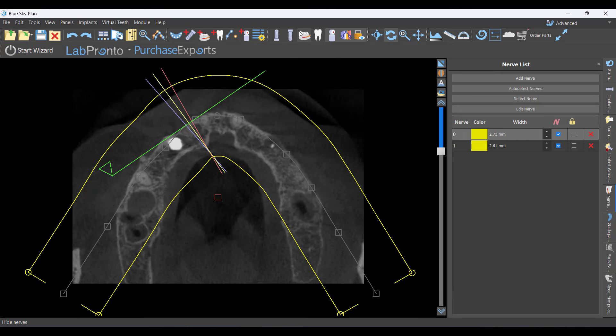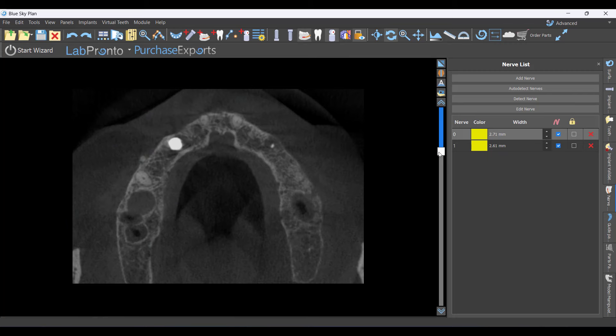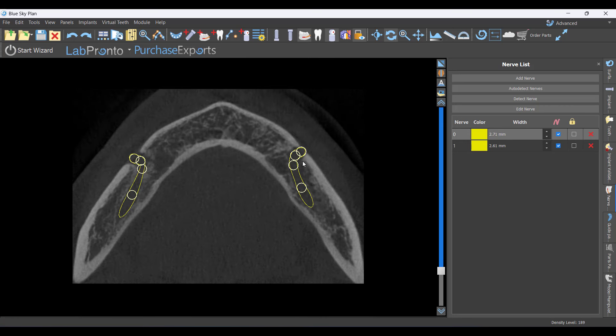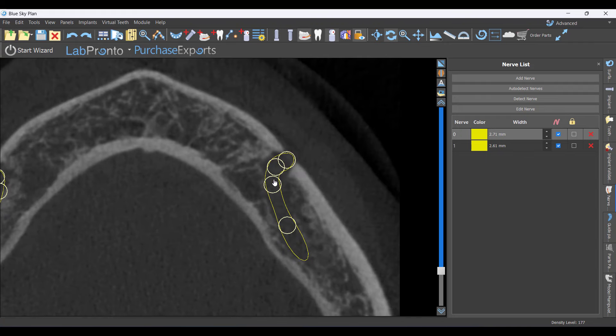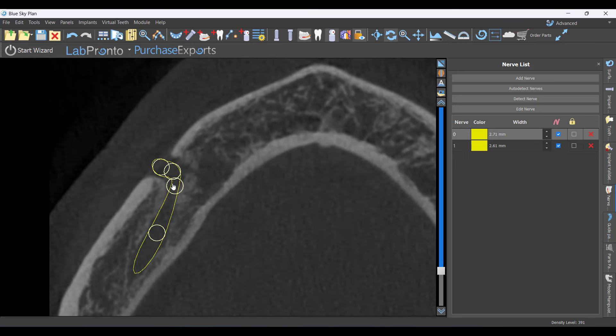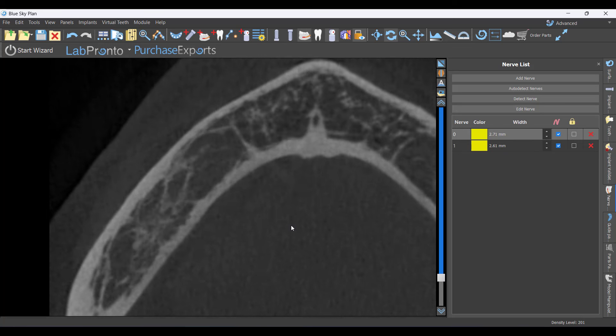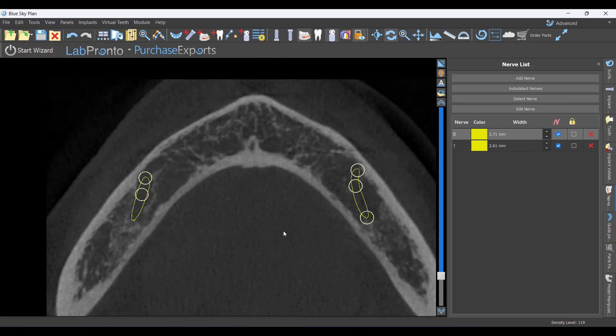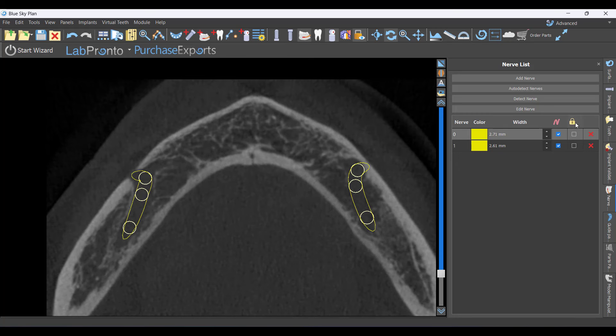One question I often get is about the anterior loop. I go to the axial slice — the top middle window — and navigate to the level of the mental foramen. Zooming in, this looks like maybe just a one-millimeter loop. As I go down, you see the canal continuing, but it never comes back — that's a dead giveaway that it's the incisive branch, which doesn't really factor into our implant placement.